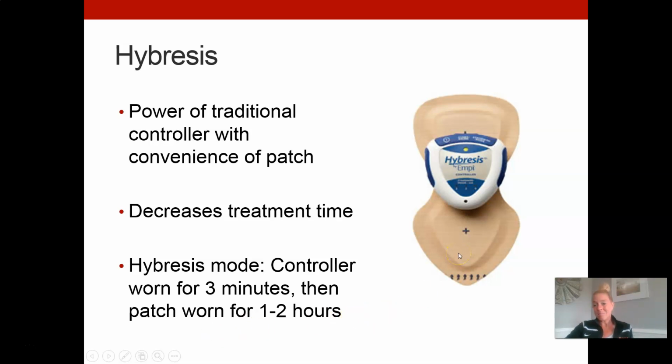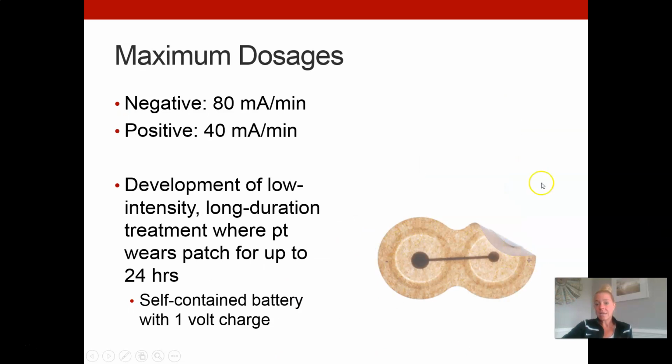But Empi went out of business, and so with that kind of went hybresis. So I do still have it that I can show you. Like I said, I don't know that people are using it anymore, especially with the creation of these types of patches. I know a lot of clinics have sort of switched over and are doing these, as well as some traditional treatments as well.